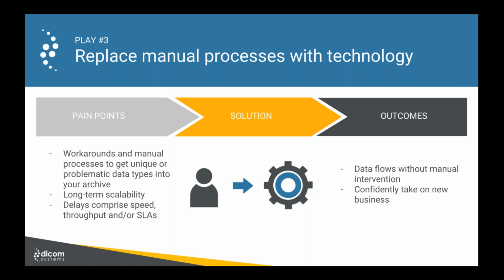Some other things that we were doing is routing of secondary captures. So when we read mammo cases offline or offsite with our clients, we need to send them back secondary captures. So this process, the secondary capture is triggered on our PACS platform, and then the DICOM Systems tools know where they need to go based upon a series of rules and route those secondary captures back to the client. That way, that patient's record remains intact on the client hospital system.